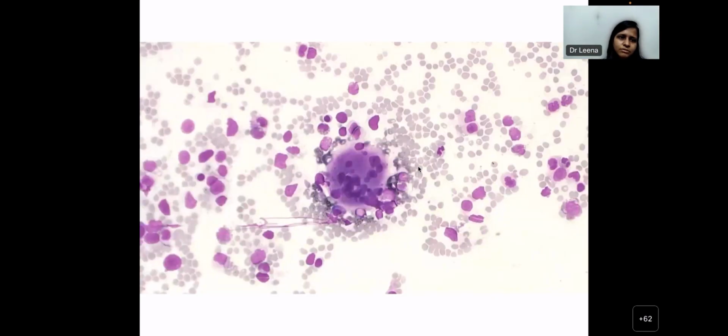Fragmentation of nucleus. So what term do we use for this? What are the features of this dysmegakaryopoiesis? Do we use the term hyperlobated or hypolobated? Anyone else? Aishwarya? What term do we use for a nucleus like this? Jhansi, do you want to attempt it? Yes, ma'am. It is a dysmegakaryocyte. It has megakaryocytes with separated nuclei, ma'am. Very good, with lobes completely separated.